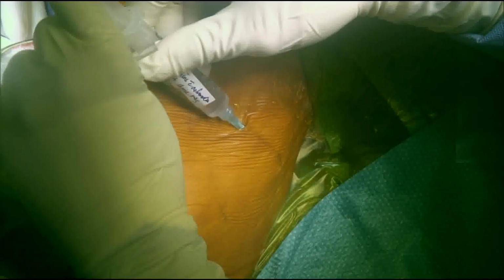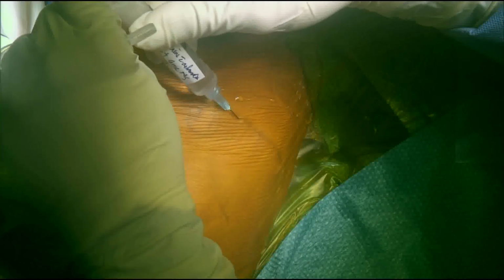As you can see here, he is starting out with injecting some local anesthetic and epinephrine to decrease bleeding at the site. It is important to be meticulous with hemostasis during this surgery for both the abdominal portion and the spinal portion in order to decrease the risk of post-operative wound complications.